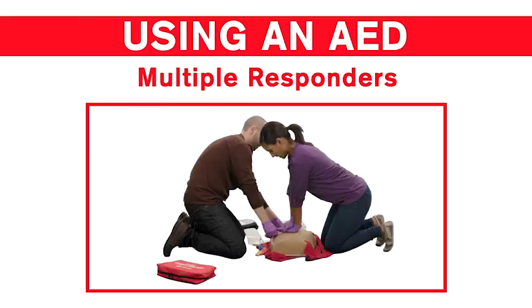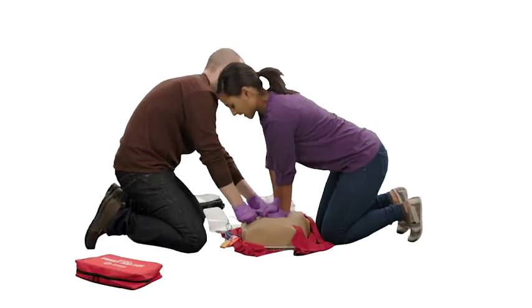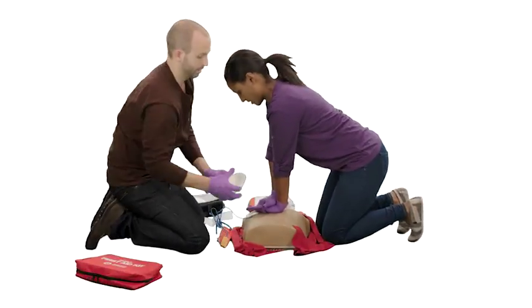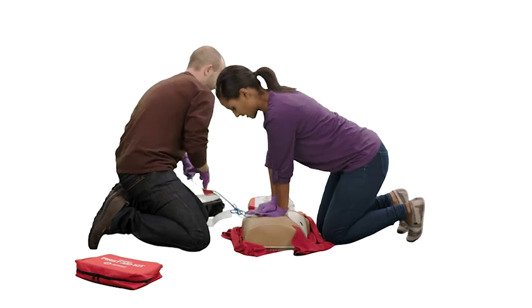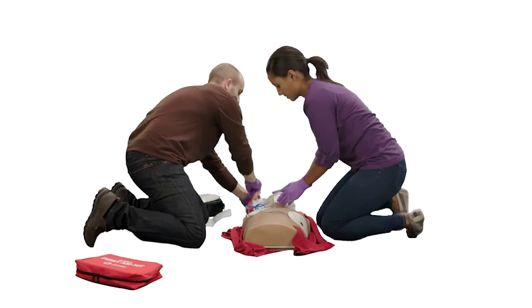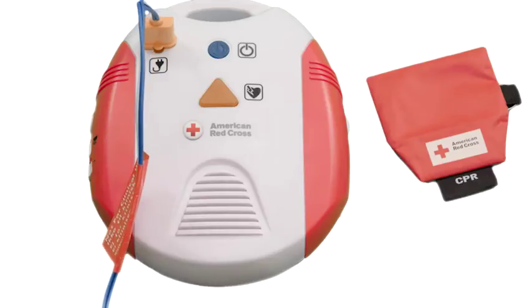If there are 2 or more responders, the steps will be slightly different. Responder 1 will continue CPR, while Responder 2 sets up the AED. When the AED prompts, analyzing heart rhythm, Responder 2 says, "Clear."